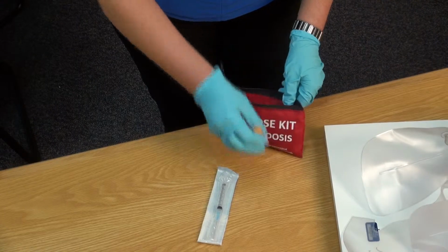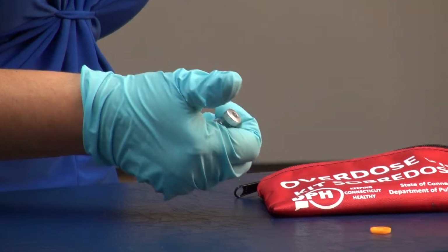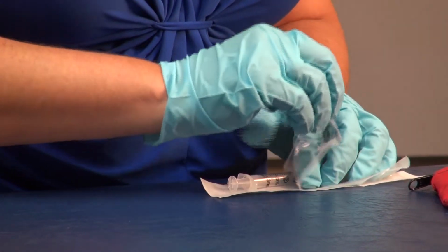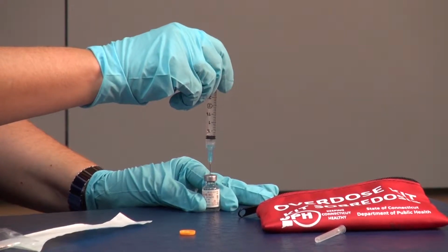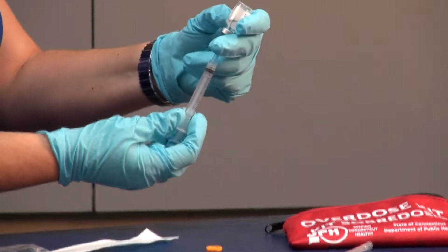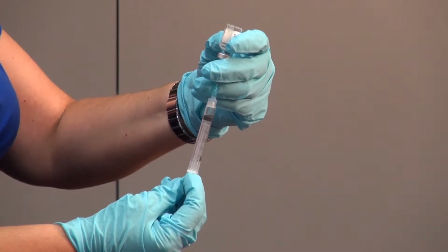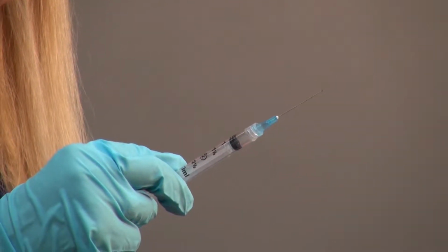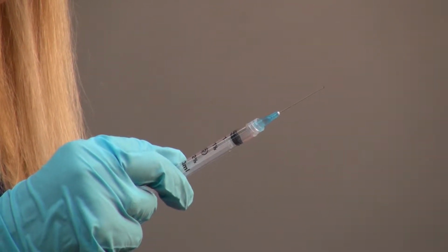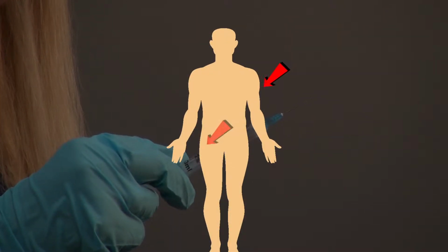For intramuscular injection using a syringe, pop off the orange top of the vial, remove the syringe from its packaging, and insert the syringe into the vial. Flip the vial upside down and remove the entire amount of Narcan, 1 cc, by pulling down on the plunger. Remove any air bubbles from the syringe by carefully pushing the plunger in. Insert the syringe into the upper arm or thigh muscle and push the plunger in.